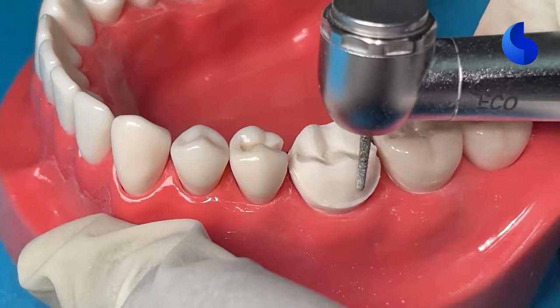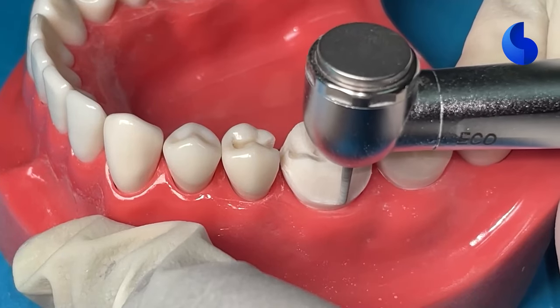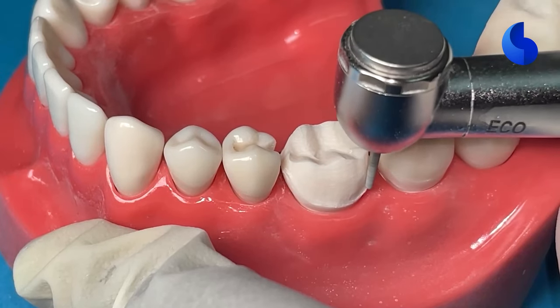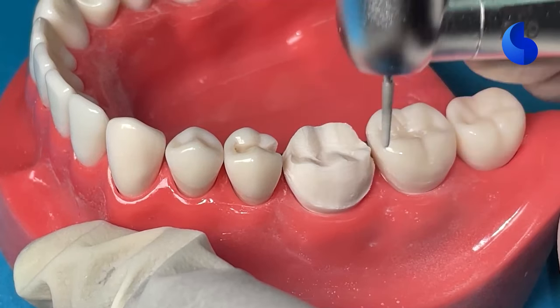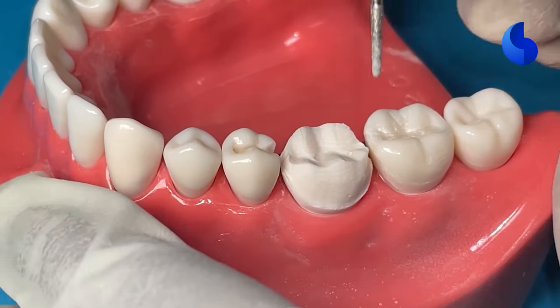Now we've broken contact on both the mesial and the distal surfaces, so we can switch back to our 856-016 burr and start refining your margins. And now that you have that space you need, you can use this burr to go through the proximal surface and create that 1 millimeter of that beautiful margin that we are looking for.